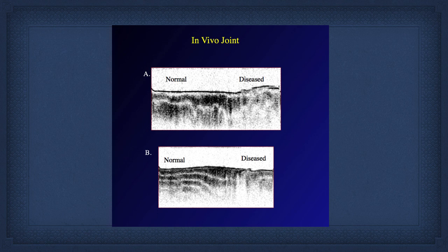And if we look at the bottom left, you see those banding patterns. That's the polarization state, rotating as it's passing through the organized collagen. So this is cartilage in vivo in a human. And because these were total knees, we actually got the histology from them when the knee was removed afterwards.